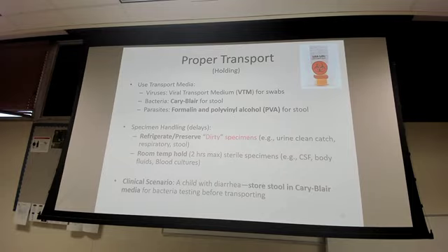Okay, so here's proper transport. This is another important slide for you all to know. Transport media: all viruses will be transported using a VTM swab. Cary-Blair is for the stool. For parasites, it will be formalin or PVA, also for stools if you're looking for parasites.